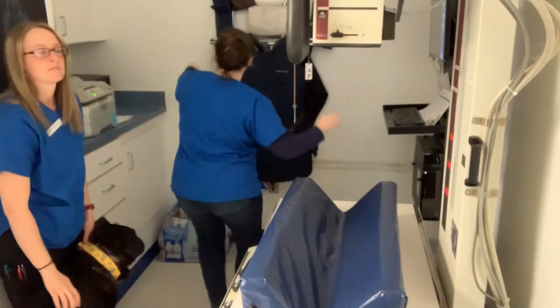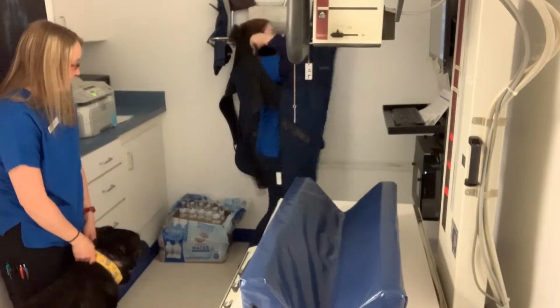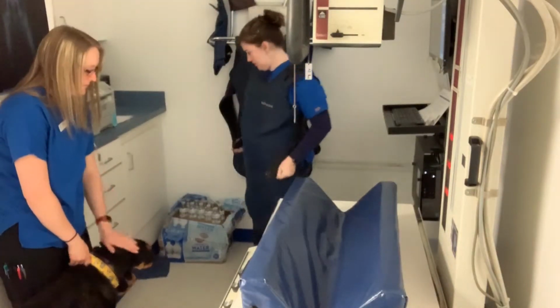Hello, my name is Julianne, and this video is covering how to perform an upper GI study with barium. I did not have a real GI case to practice this study, but I am using Brooks the Rottweiler to practice my radiographic views.